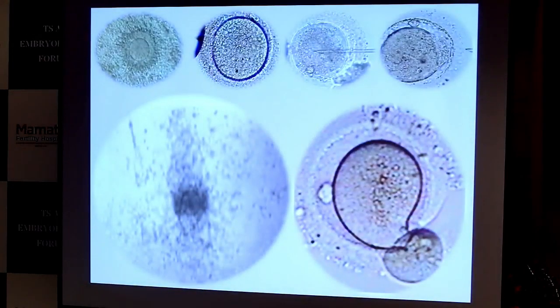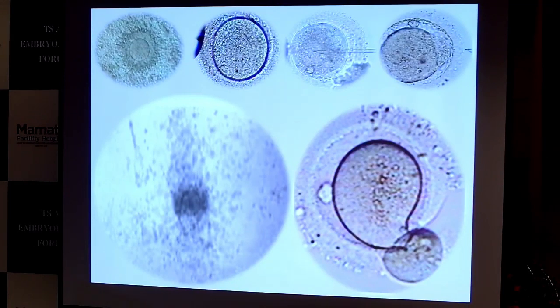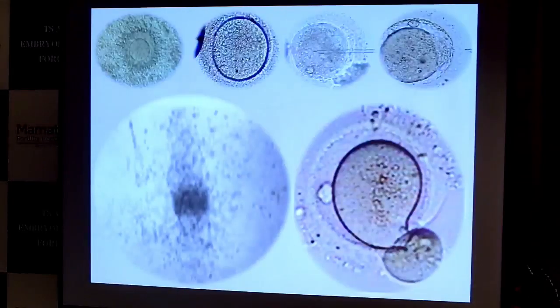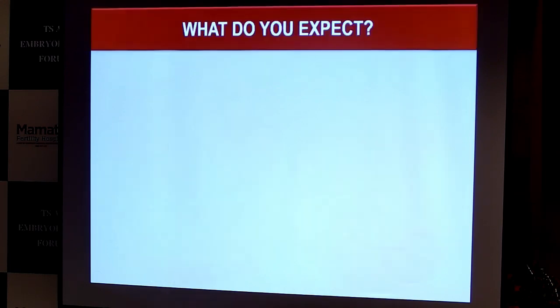And most important for those of us who are doing the ICSI, the degeneration that happens in immature eggs, especially in PCOs. We know that the plasma membrane characteristics are not really so good sometimes. And when you go with your needle inside the oocyte, can you see this? There's no funneling at all here. You can go straight into the oocyte without any resistance. Such oocytes don't do really well. There is immediate degeneration happening right under your eyes.